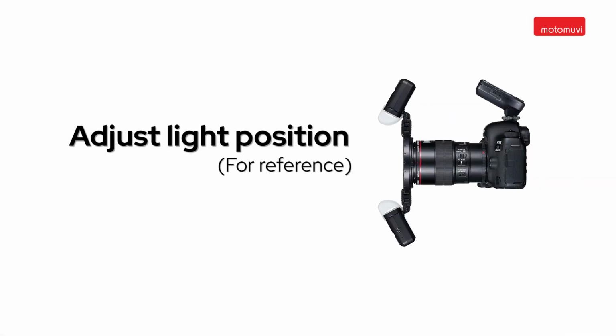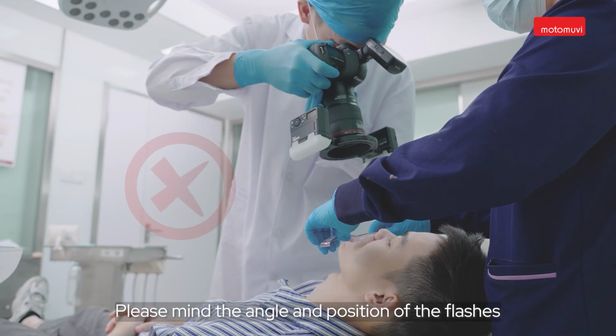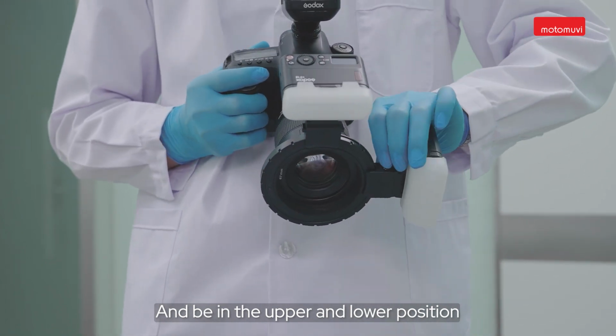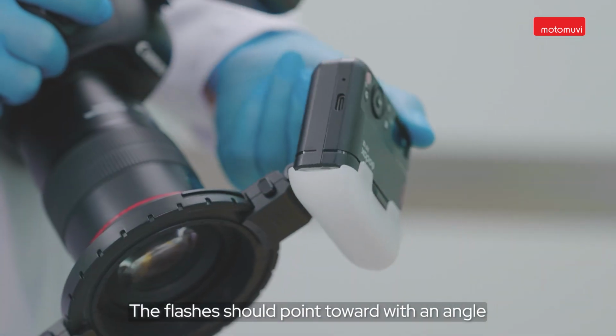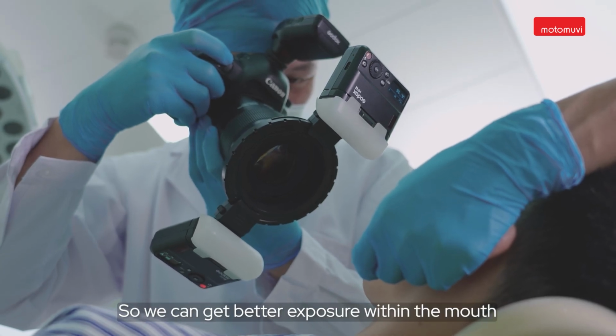Adjust the light position. Please mind the angle and position of the flash and keep it in the upper and lower position. The flash should point toward the teeth at an angle so we can get better exposure within the mouth.